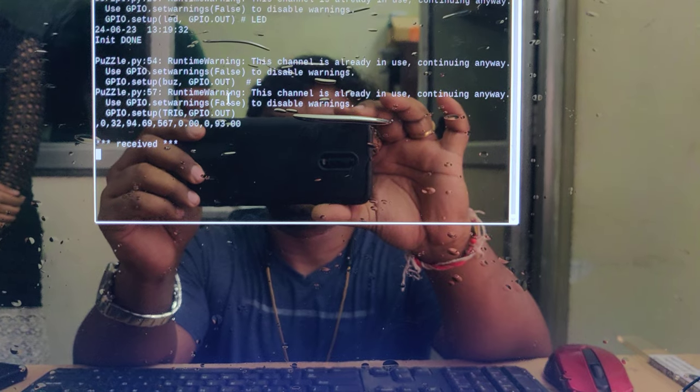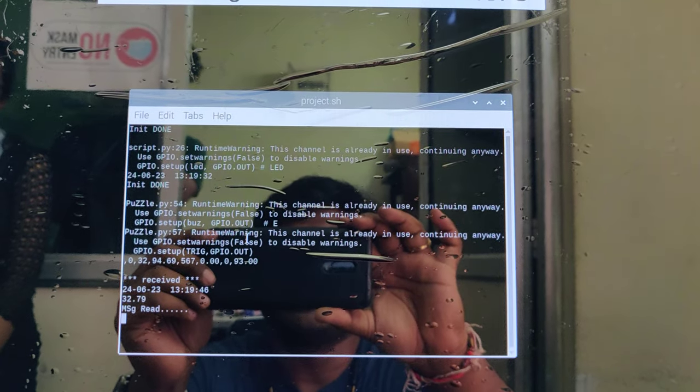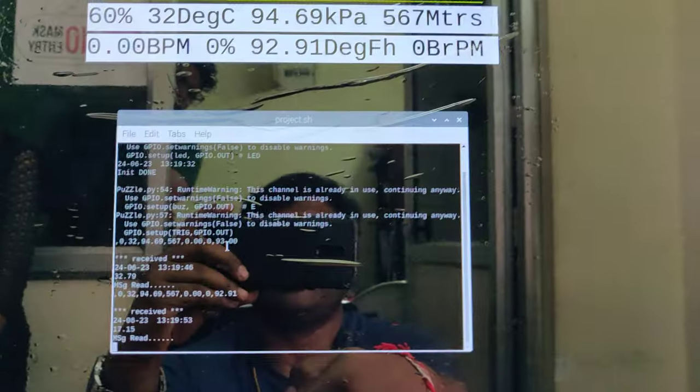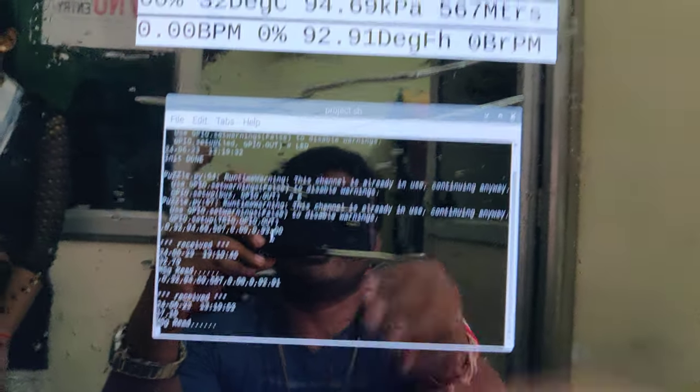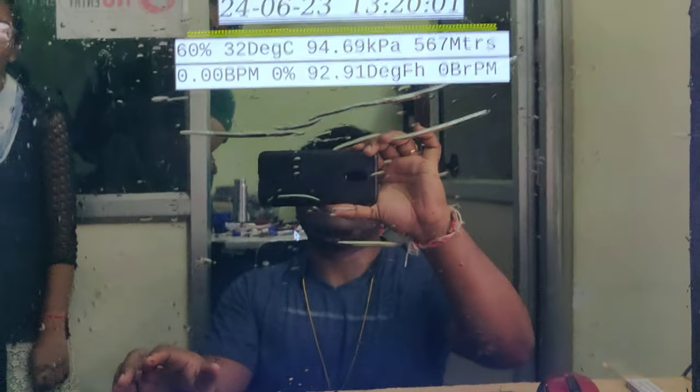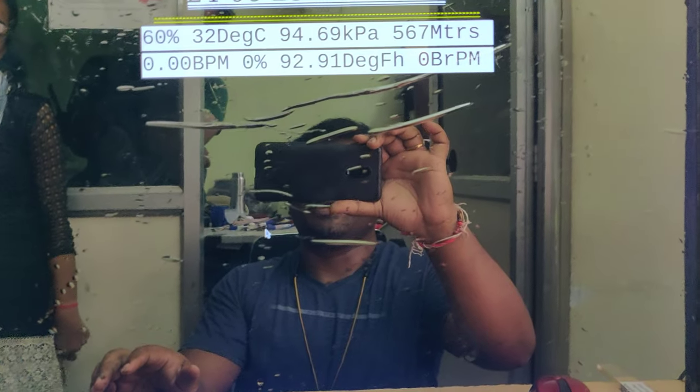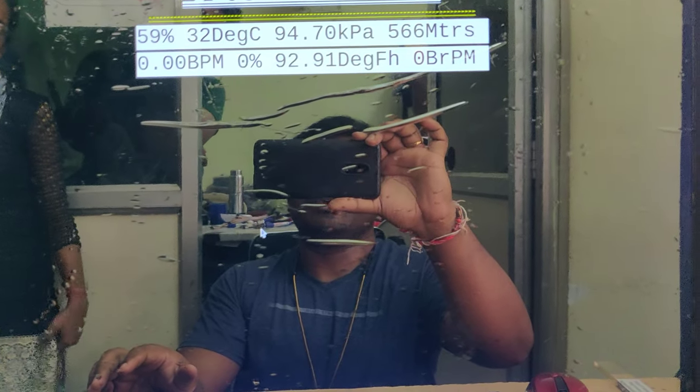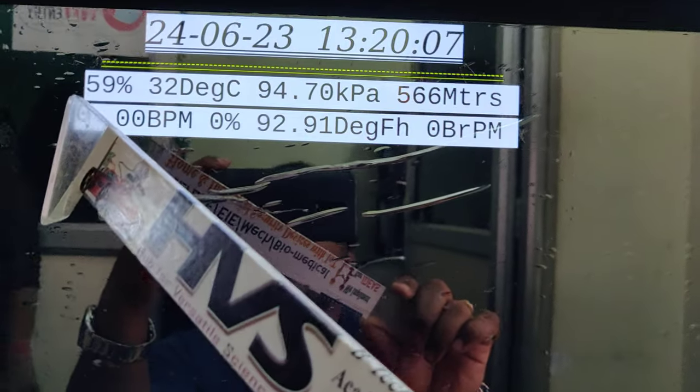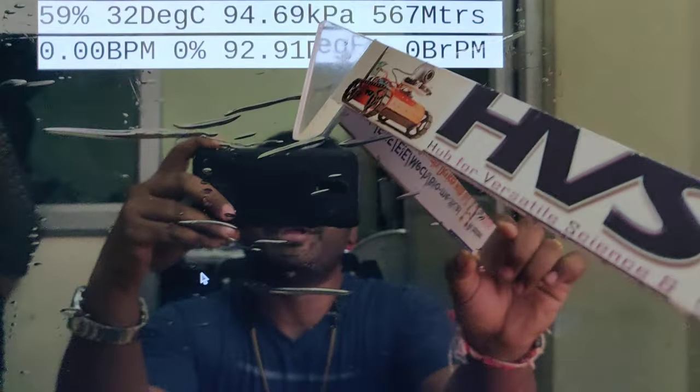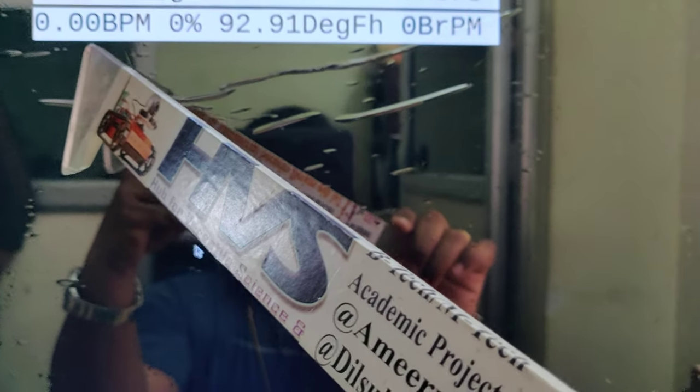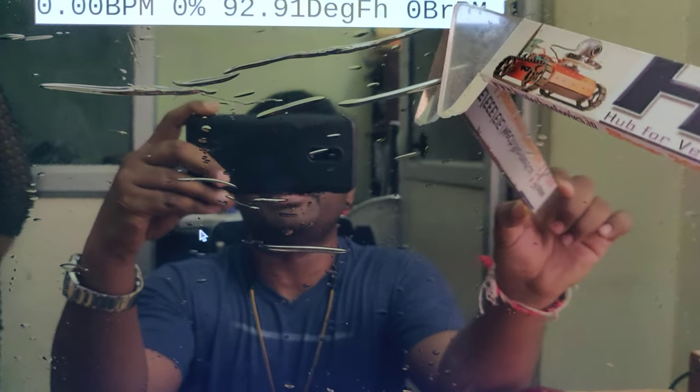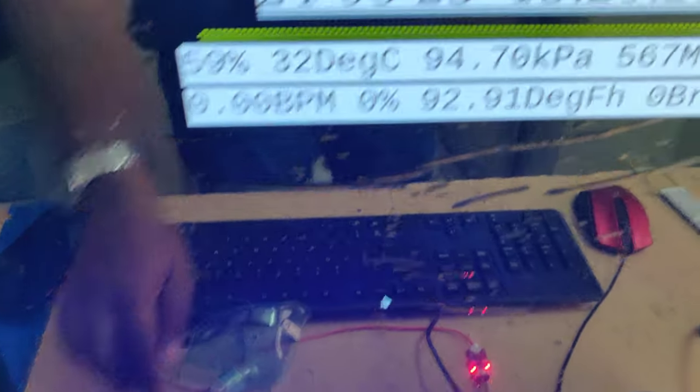We got the message data, which will appear here. Whenever a person is detected nearby this mirror, health parameters are also mounted. You can see the other parameters. On successful reading of these eight messages, you can Alt+Tab. Now only the date and time parameters along with humidity in percentage, temperature in degrees Celsius, pressure, and altitude are shown. First one is BPM, this is heart rate, SPO2 percentage, body temperature in degrees Fahrenheit, and breaths for respiration rate.